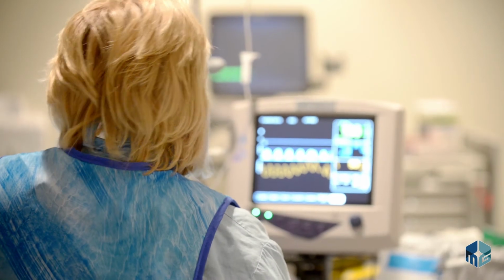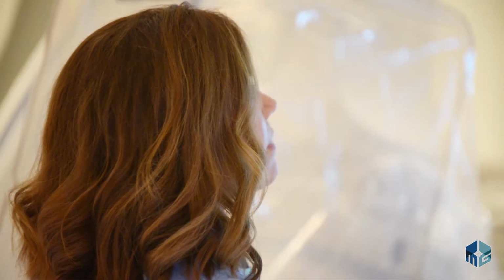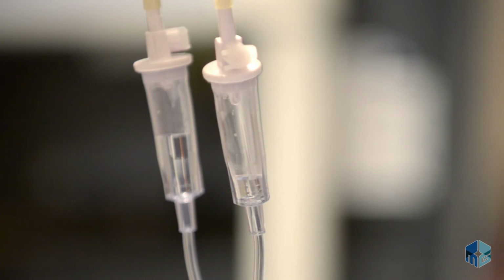When somebody comes in for an ablation, most of the time my patients can expect to go home later that same day. When you come into the hospital, an IV is placed. Through the IV, you're given medication called conscious sedation, which means you're brought to a level of being very comfortable during the procedure, but you won't be completely out or unconscious. Only rarely do we use general anesthesia.